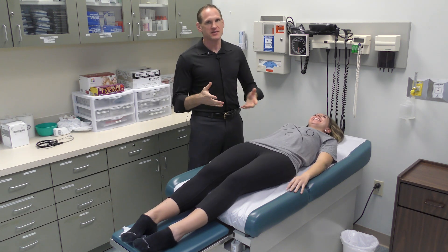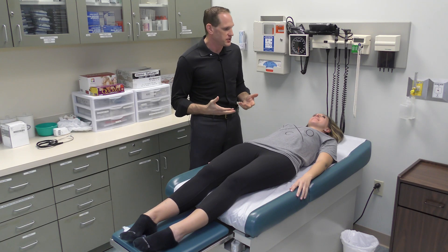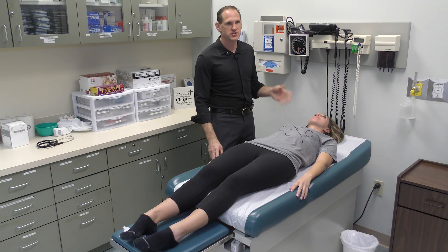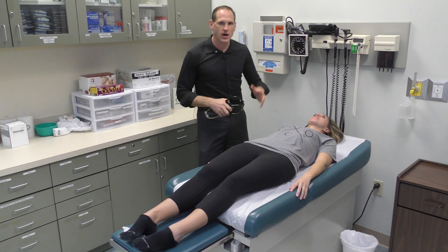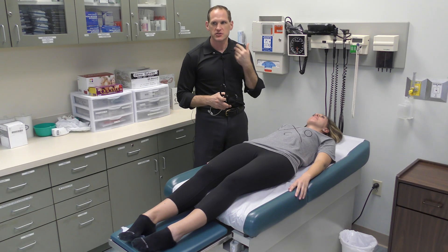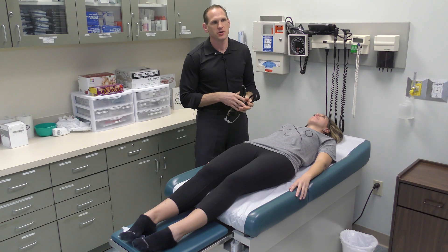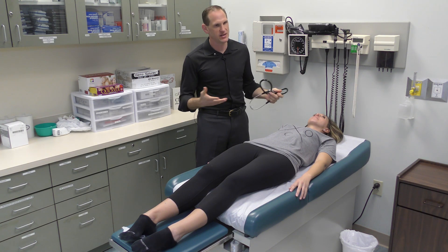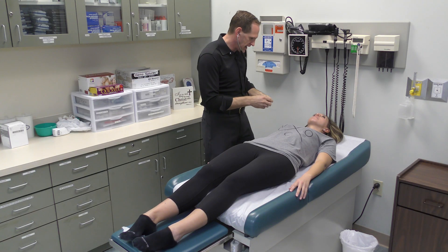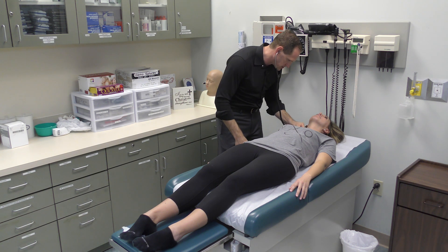That's it for the heart exam. We're now going to proceed with the peripheral vascular exam. The first part is to auscultate the patient's carotid arteries, and you always, always, always auscultate them before you palpate them. The reason is that if there's a bruit or a plaque there, palpating could break that bruit loose. By auscultating first, you're less likely for that to occur. We're going to use the diaphragm and gently place it on the patient's artery.